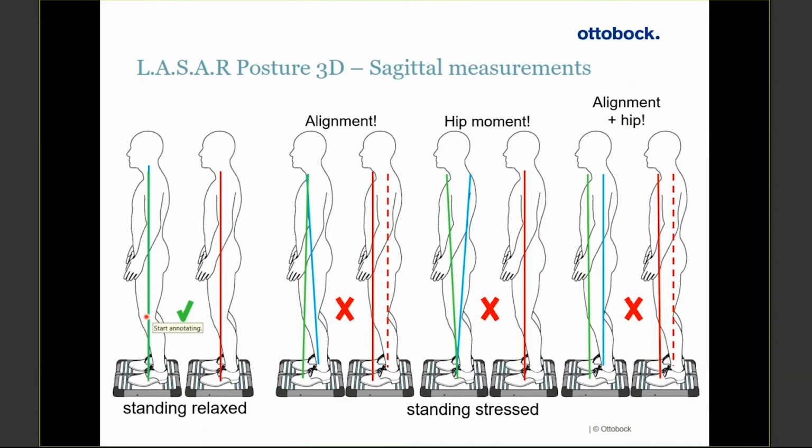And a lot of people ask me, how perfect does it have to be? As close as possible, but often there are times where we can't get it on top of each other, but as close as possible, and most importantly, parallel.